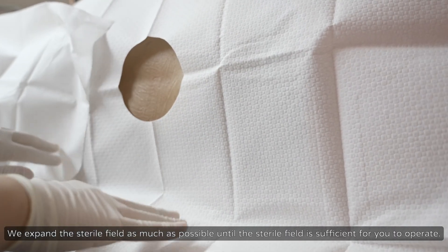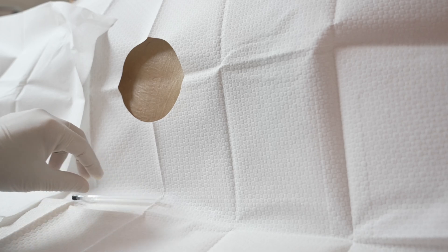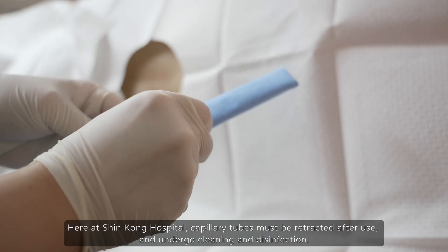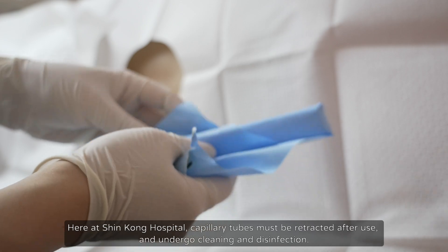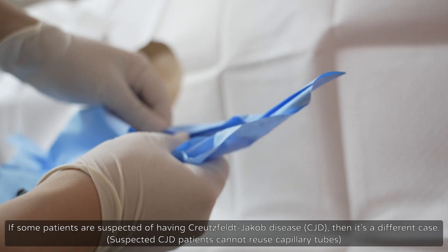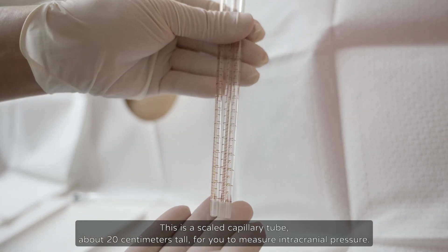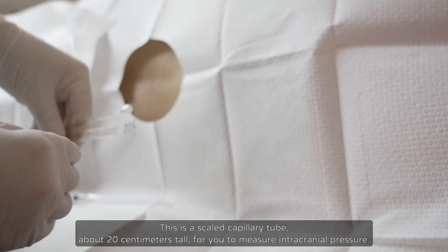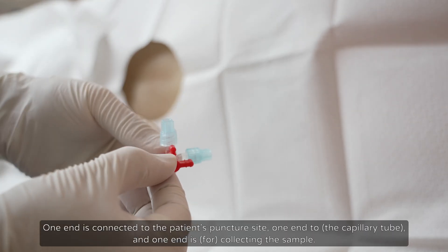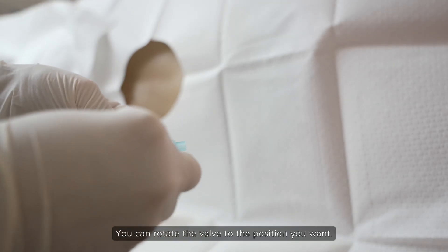We expand the sterile field as much as possible. This is a needle for lumbar puncture. This glass capillary tube's main function includes measuring the intracranial pressure (ICP) before and after. Here at Shinkong Hospital, capillary tubes must be retracted after use and undergo cleaning and disinfection. If some patients are suspected of having Creutzfeldt-Jakob disease (CJD), that's a different case — suspected CJD patients cannot reuse capillary tubes. This is a scaled capillary tube, about 20 centimeters tall, for you to measure intracranial pressure. This is what's called a three-way valve: one end is connected to the patient's puncture site, one end to the capillary tube, and one end for collecting the sample. You can rotate the valve to the position you want.